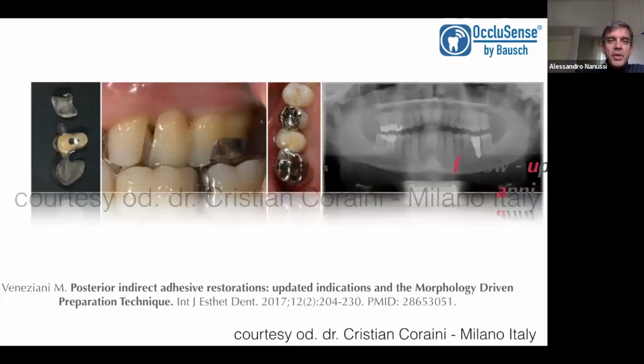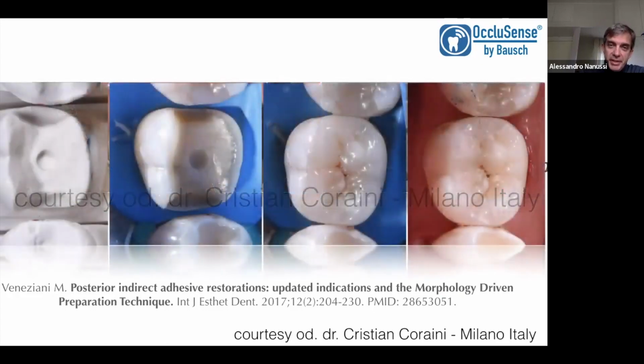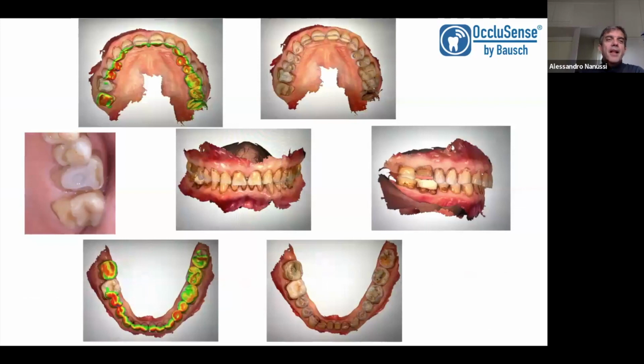Well, we have so much information from papers and literature about how to model a perfect smile, a perfect restoration, but only for the teeth, and that is not enough now. This is the scanning of the arches of the patient. I'm sorry, there is a picture that has to be the opposite. You can see the static situation of the scanning.